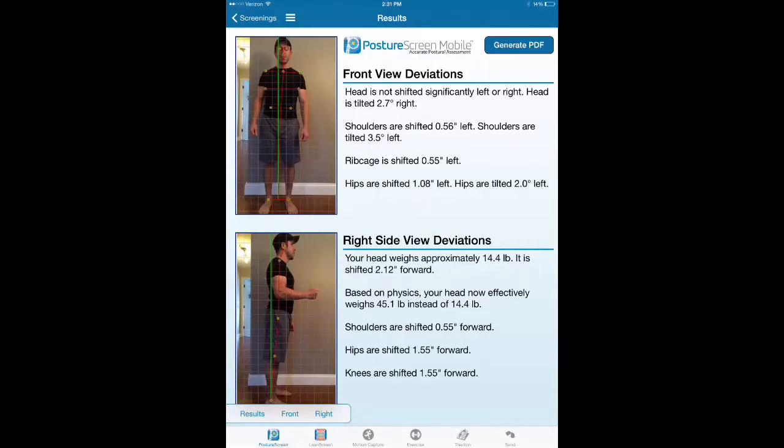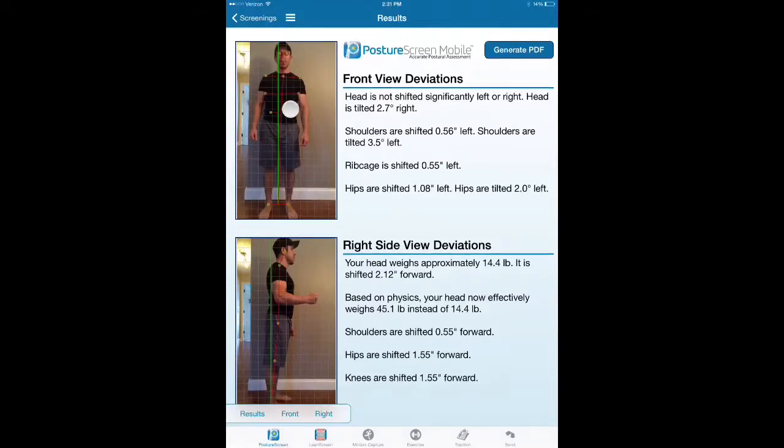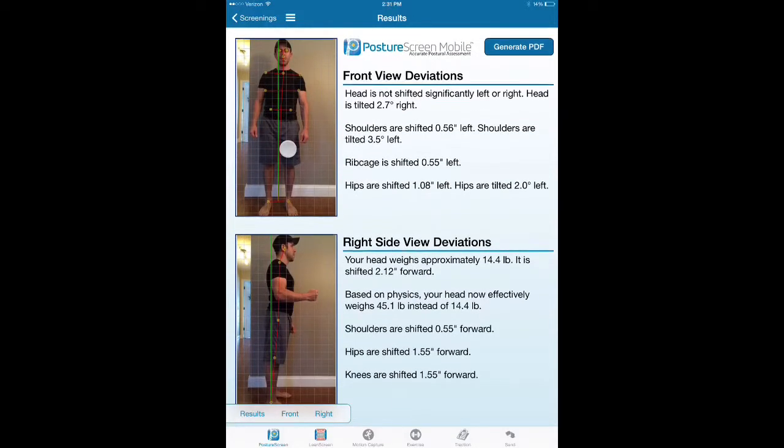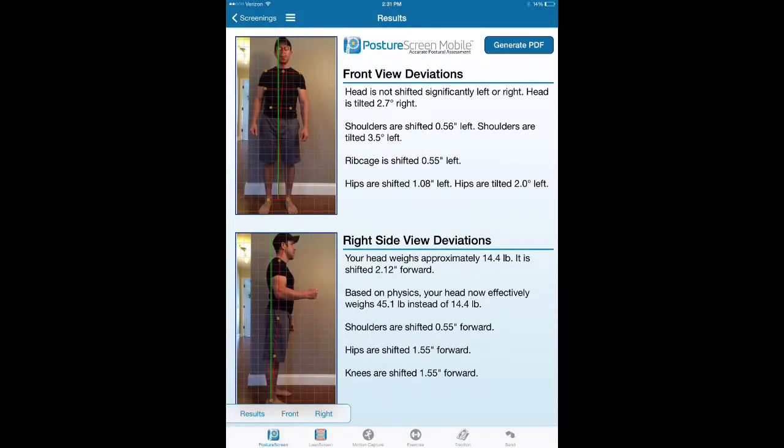We're going to go through just the two views how the app Posture Screen Mobile will assess posture. Below or above this video, you'll have some text describing this, but quite frankly, the most common question that we have is right here.